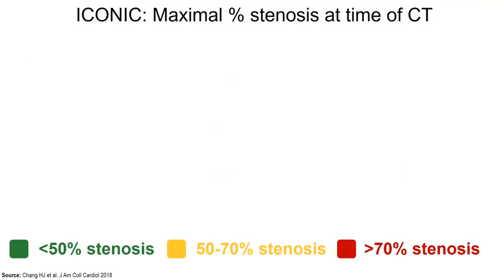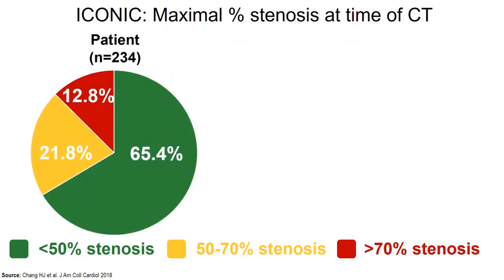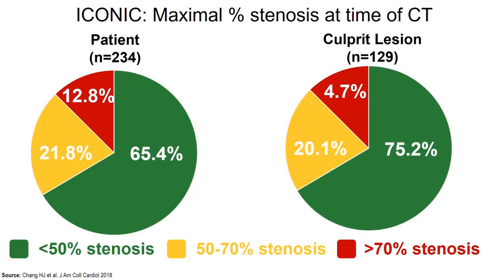And the first question that he said was, you know, why are we trying to look at the stenosis? We know from Ambrose and all of the other studies that were quoted in the 1990s that stenosis didn't seem to be associated with future MI risk in the way that non-obstructive lesions did. So the first thing he did was repeat what Ambrose did. And he found exactly the same thing that Ambrose did, which is that the majority of lesions that you see on a CT scan that will cause heart attacks are not greater than 50% stenosis. So then he said, well, maybe it's the plaque, it's not the patient. And it turns out there it's even worse, right? Only 4% of the lesions that you see on a CT scan that are greater than 70% will be the cause of a culprit in the future. More than 3/4 of the culprit lesions that cause MI are less than 50%.